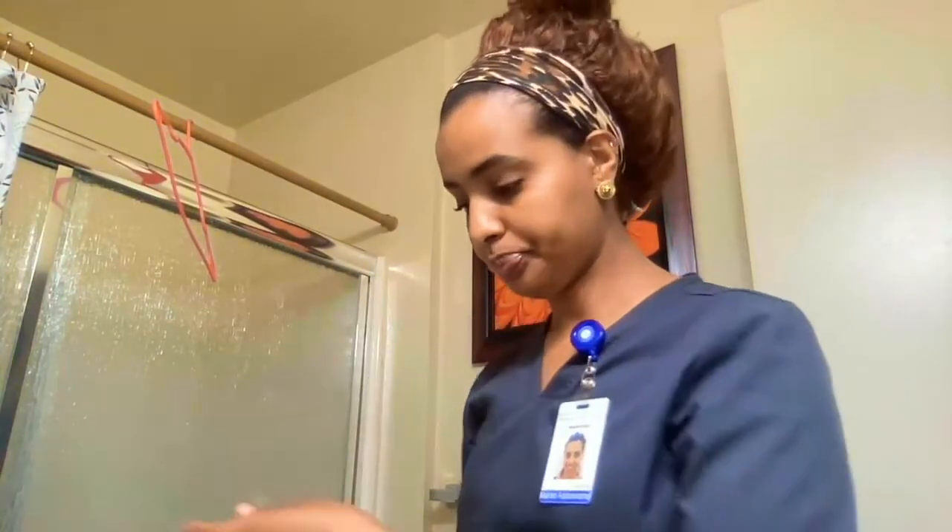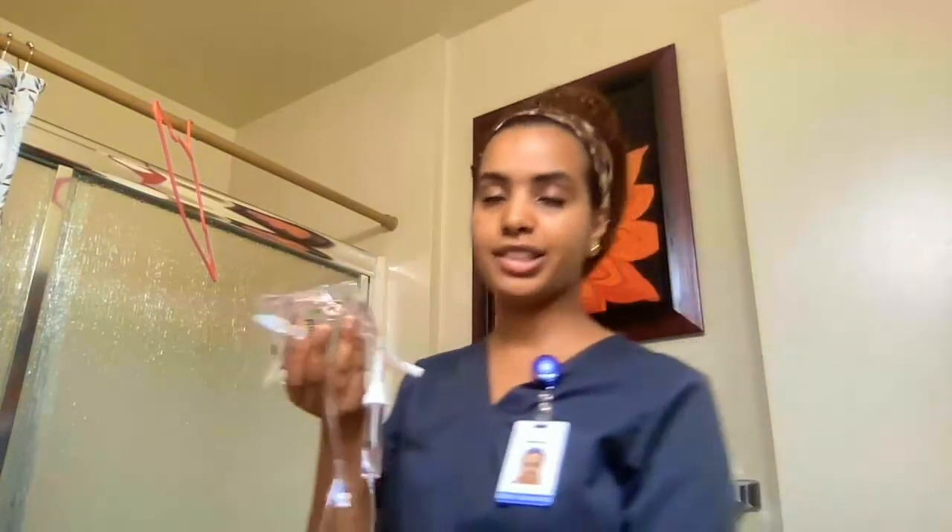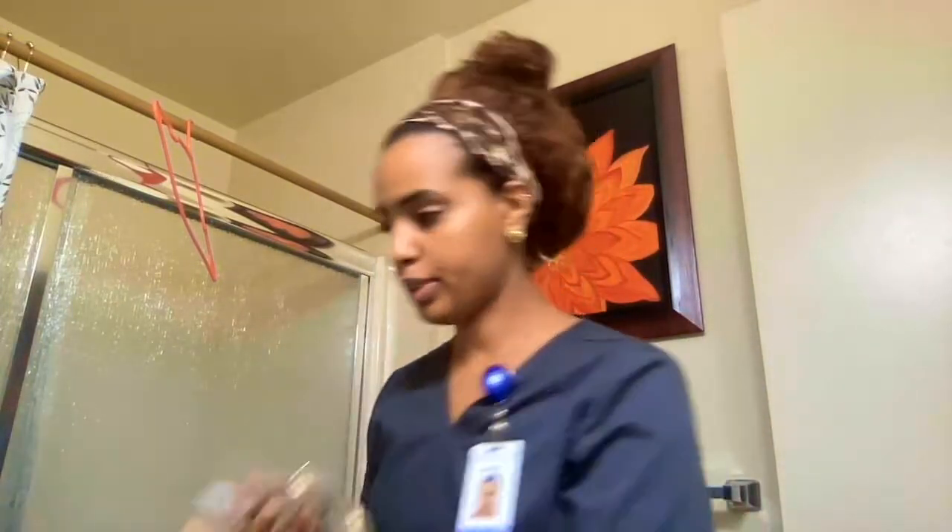That's one full minute that I counted. Now I'm going to go ahead and set up my secondary bag, and I'll put the primary to the side.